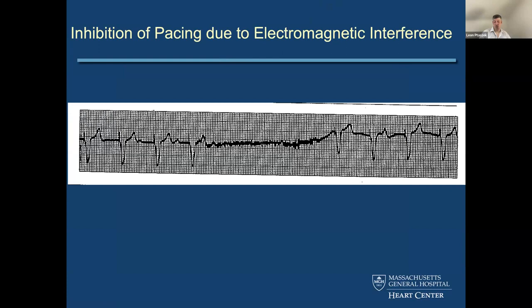It can, yes. Well, I'll put it this way. MRI can cause all sorts of things because, again, when your body is in an MR scanner, you're not just exposed to the magnetic field. As you know, the scans are the result of sensing that follows perturbation of the magnetic field, meaning you've got the magnetic field that's continuous, but then you've got radio waves that are intermittently firing that perturb the magnetic field. And it's that perturbation that leads to enough of a change in spin that's then read off as resonance, right? Magnetic resonance. And so your pacemaker can be thrown off by all sorts of things.